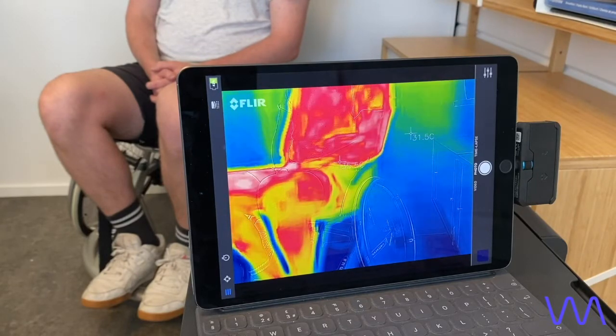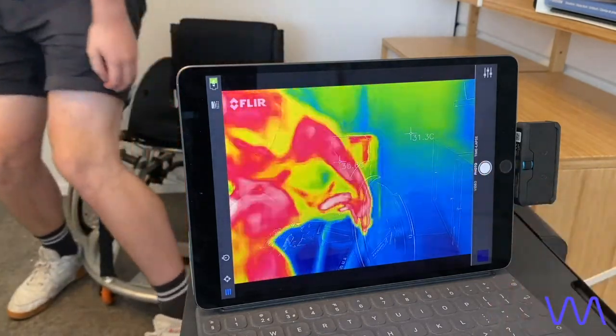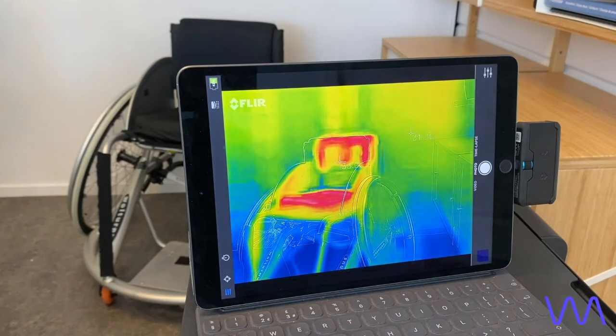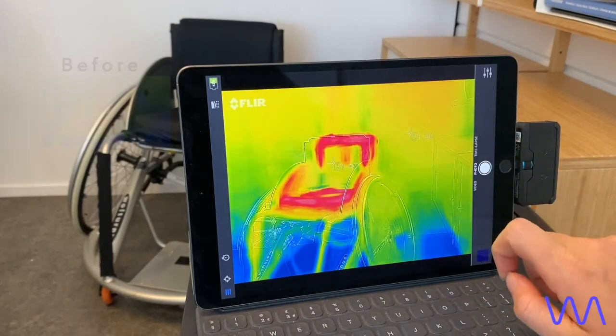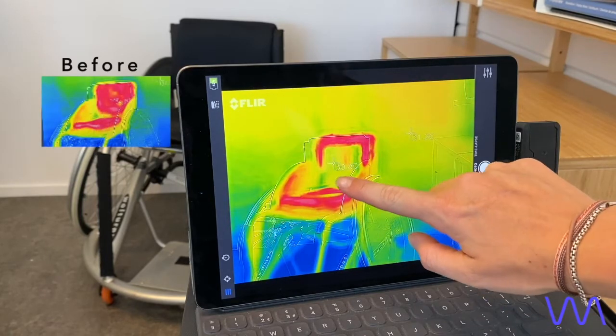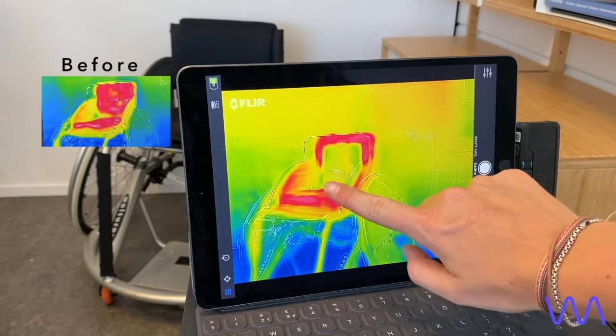So this has almost been 10 minutes. So I think it's time to have a look. You can see also that the environment temperature has gone up. Our office is super hot at the moment. Okay, so that went back to 32 degrees where the channels are. It is 31. You can see it's spreading through the whole backrest as we go. So yeah, that's 30.